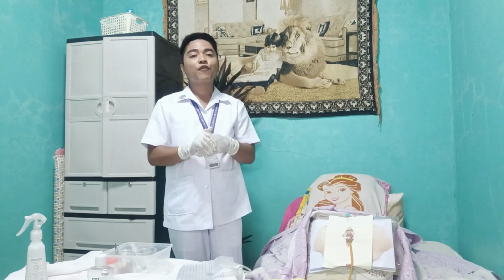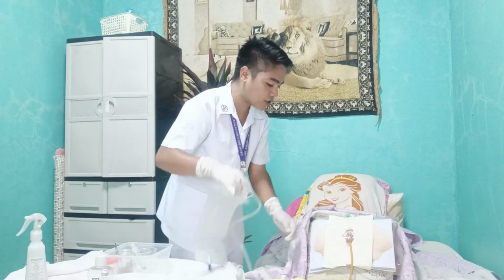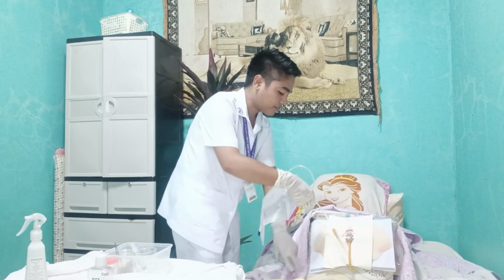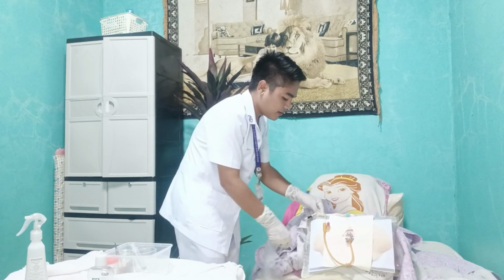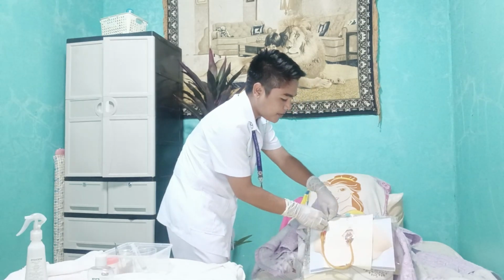Now I am going to secure the indwelling catheter by taping the catheter to the patient's thigh. For females, the thigh is the best area to tape the catheter, and for males, it would be the abdomen. Also provide some slack to accommodate the patient's movement. After that, remove the eye sheet. Let's place it first on our patient's thigh. Then tape it. Assuming that I tape it.